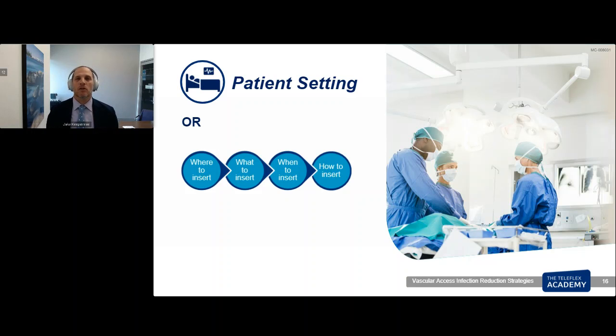When we think about compatibility of drugs and what can go through a central line, in the ICU, we often have people on a dextrose-containing fluid. We often have people on vasopressors. There's often an antiarrhythmic. There's often some anticoagulation and antimicrobials. And the reality is those are not all compatible and can't all be given through the same lumens. Yet many of those medications need to be given continuously or on a fairly frequent basis. So having adequate access is key.